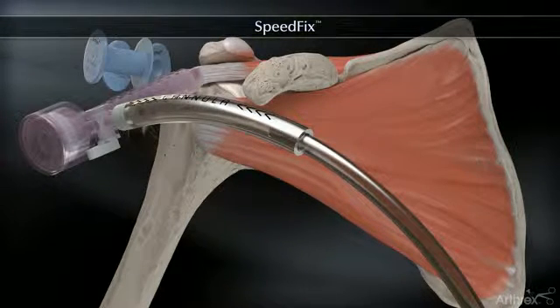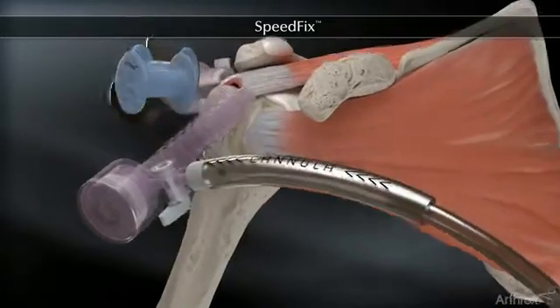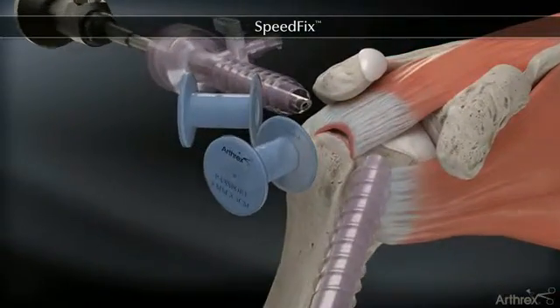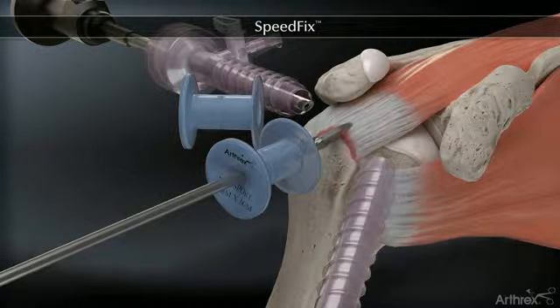The Arthrex SpeedFix is a knotless single-row rotator cuff repair that combines a fully threaded swivel lock anchor with fiber tape to quickly create a strong and low-profile construct.